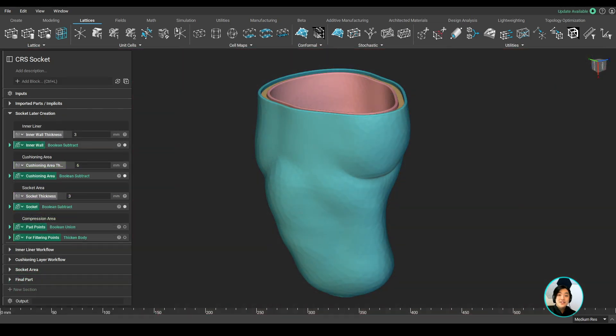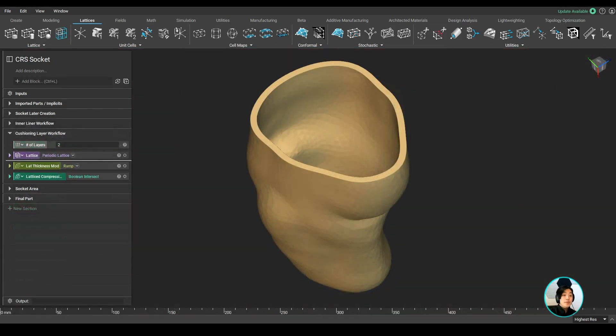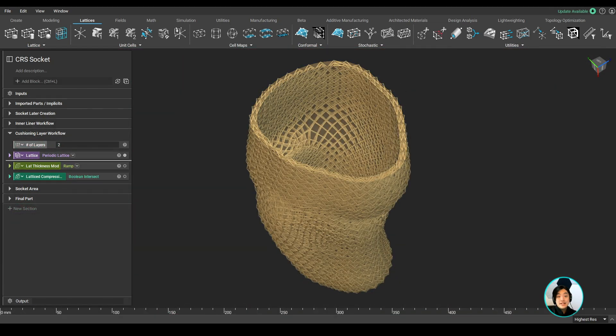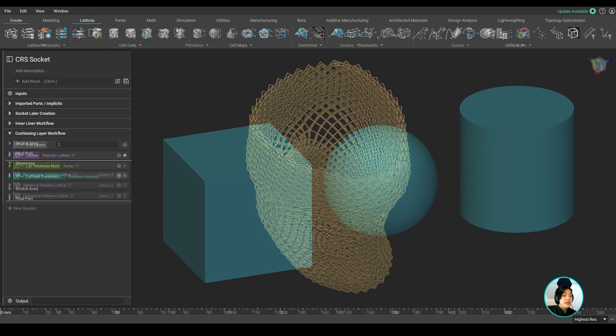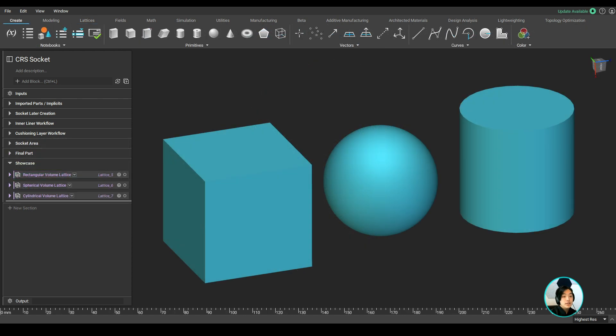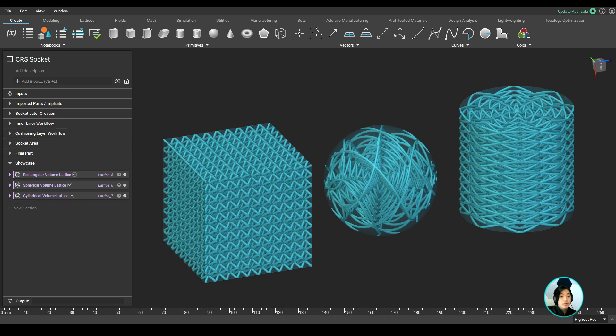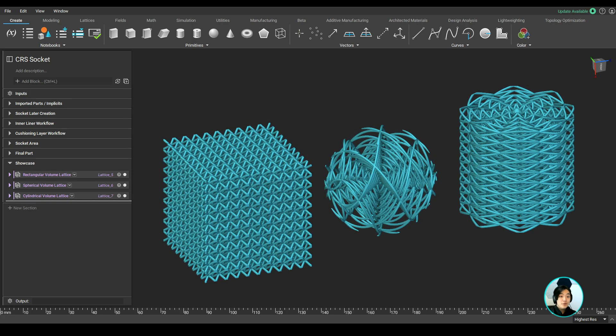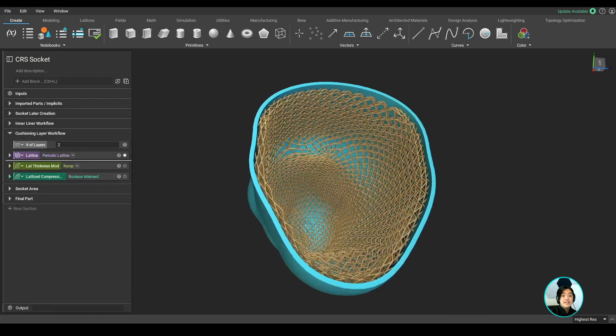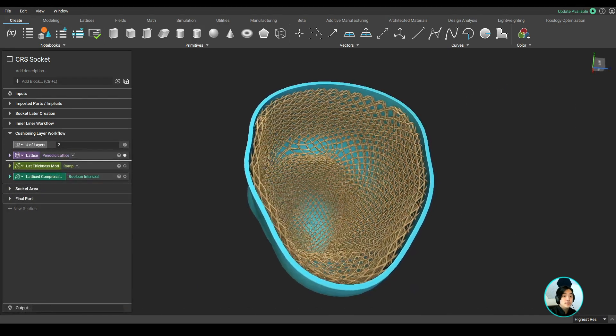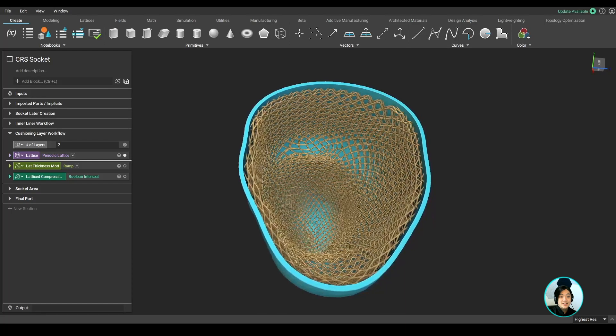Let's move on to the cushioning layer. To help with cushioning, I can infill the layer with lattices. We can take any geometry and infill the area with lattices in a rectangular, spherical, or cylindrical coordinate system. We can also make the lattices conform to the surface, which I did in this case.